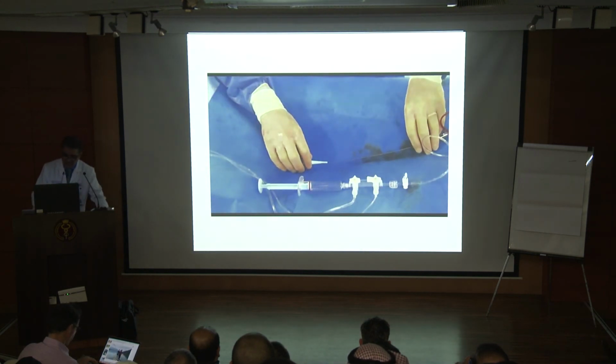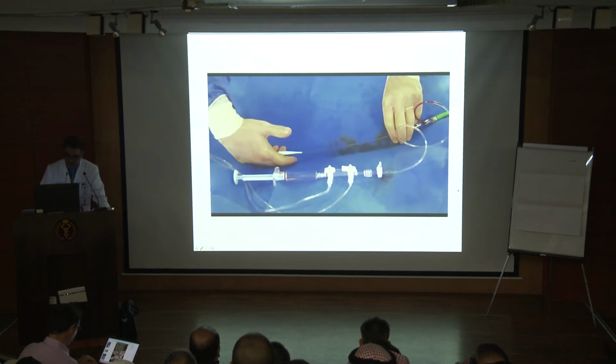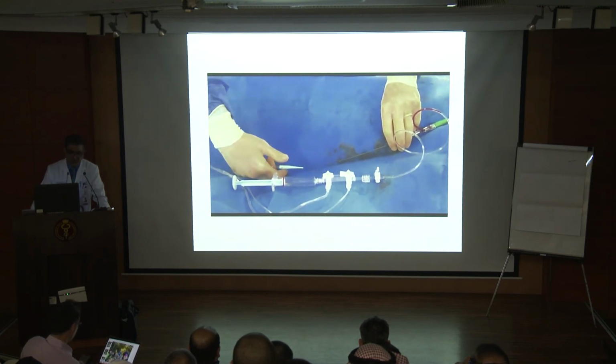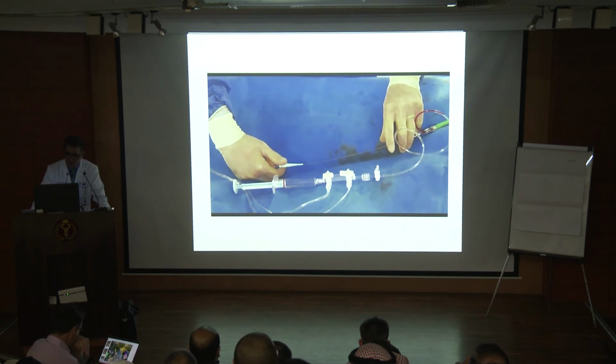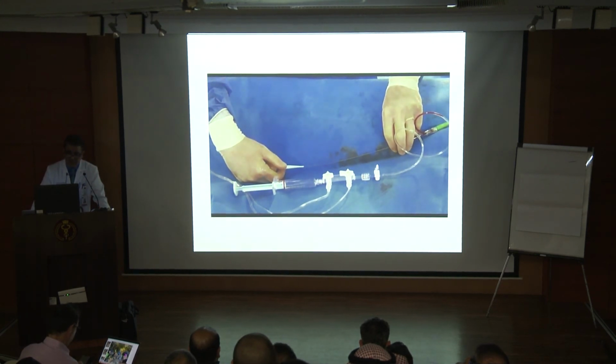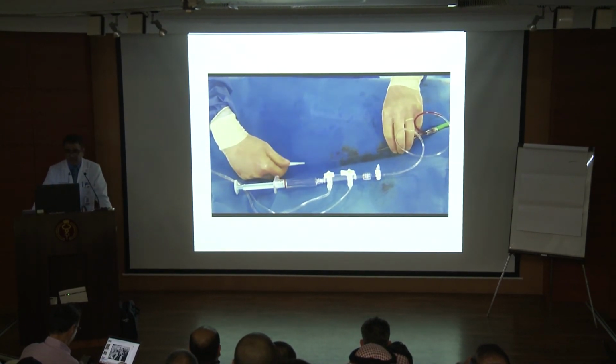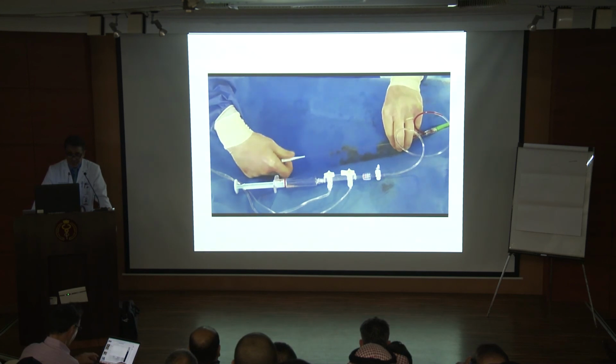How you move the microcatheter, again, I'm repeating it because it's also from James, is a two-hand technique. With your left hand you push, with your right hand you rotate. One technical tip I tell you is don't over-rotate too much.